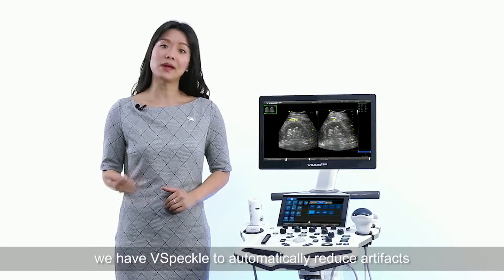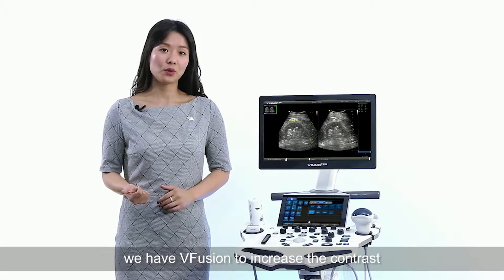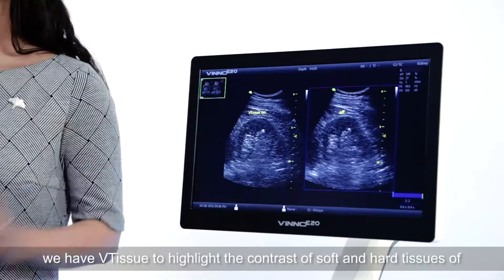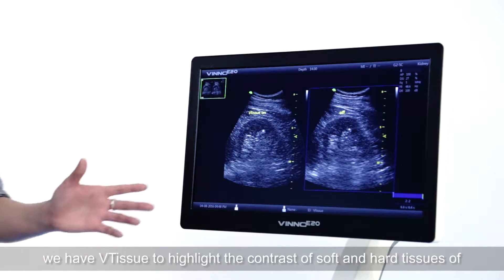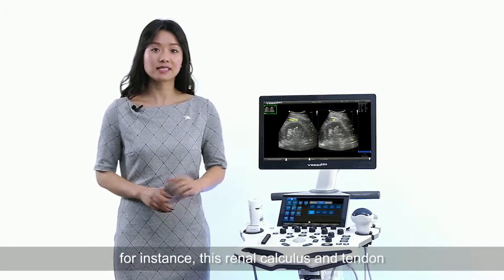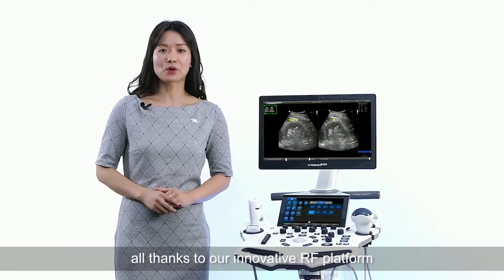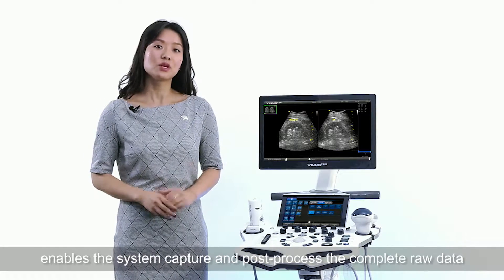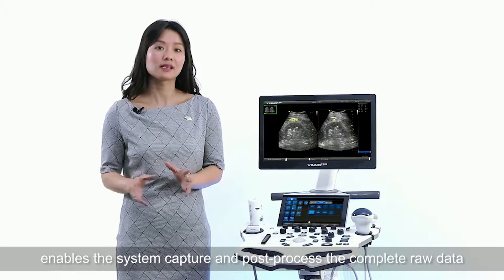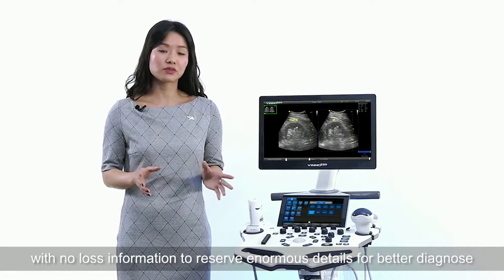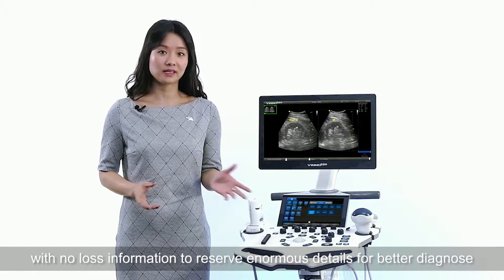We have V-speckle to automatically reduce artifacts. We have V-fusion to increase contrast. We have V-tissue to highlight the contrast of the soft and hard tissue of, for instance, this renal calculus and tendon. All thanks to our innovative RF platform that enables the system to capture and post-process the complete raw data with no information loss to preserve enormous details for better diagnosis.